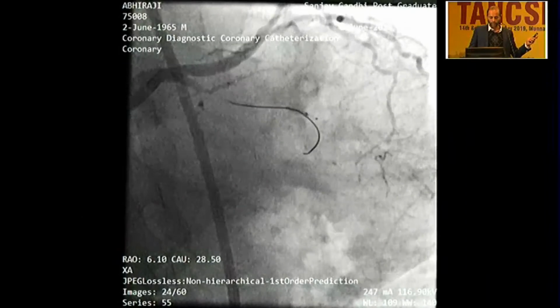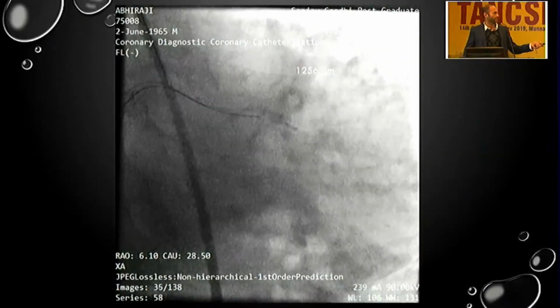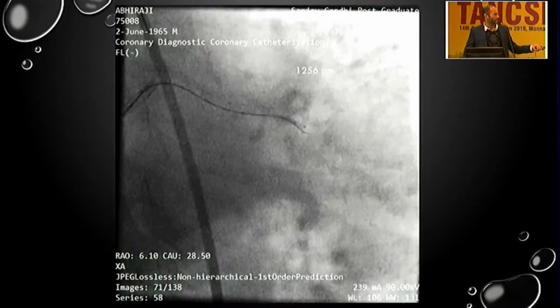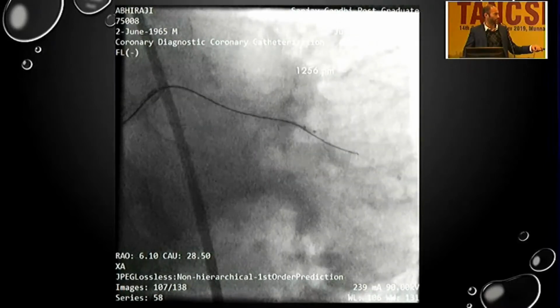So at this point, initial stick didn't work. This is the second stick, and it was actually 30 minutes after we decided to knuckle it. And that's the wire getting back in. And had to kind of do this by feel, but thankfully I was able to do this.